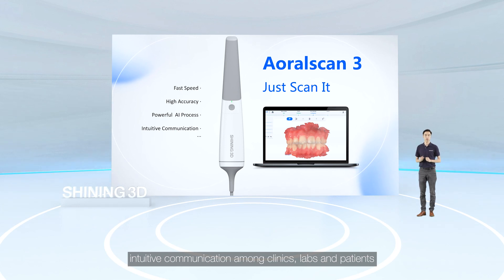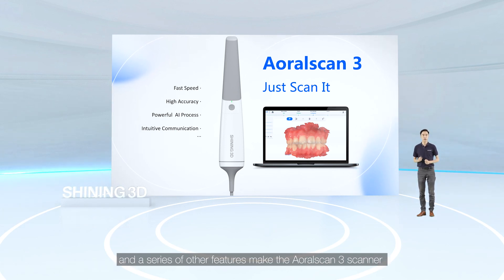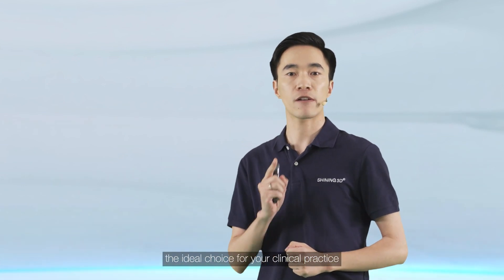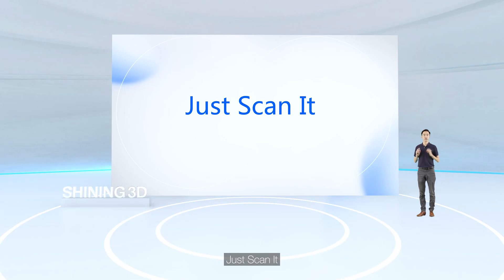Fast speed, high accuracy, powerful AI processing, and intuitive communication among clinics, labs, and patients — along with a series of other features — make the Aoralscan 3 the ideal choice for your clinical practice. Just scan it.